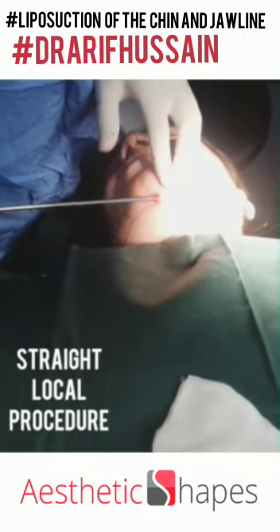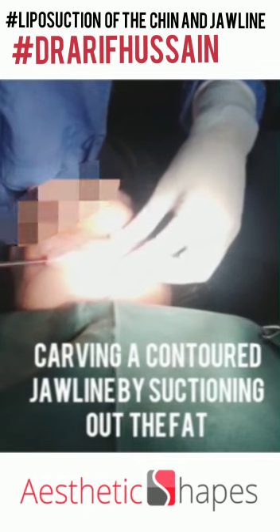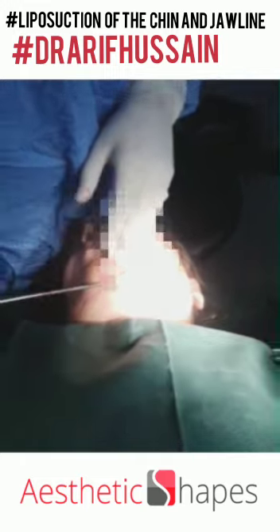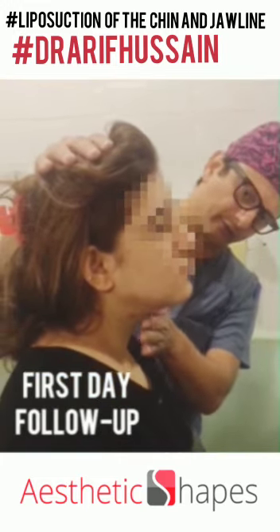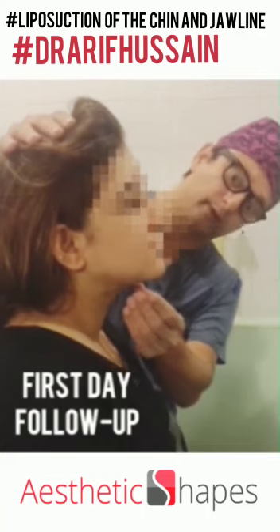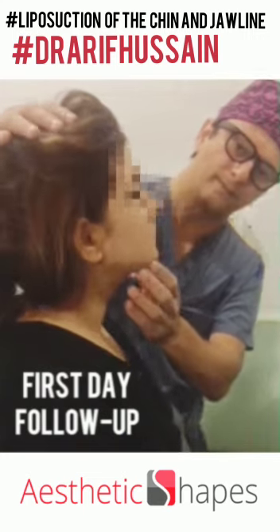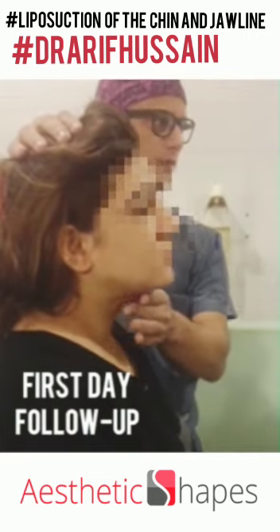I'm carving the jawline now with my power X, melting the fat. This is the first day follow-up of the chin and jawline — as you can see, the smooth contour of the double chin. I'll show you the video of the pre and before procedure: the bulging double chin. Now the jawline is contoured, and at three months we're expecting more improvement as well.